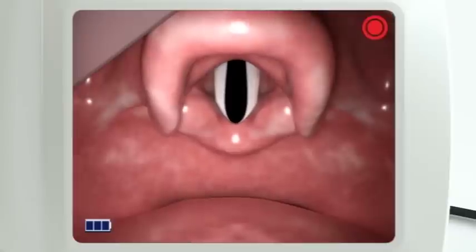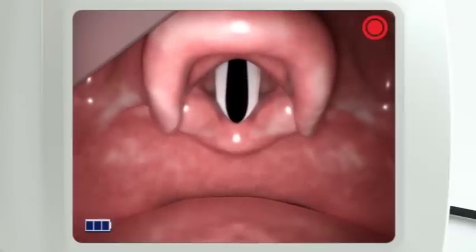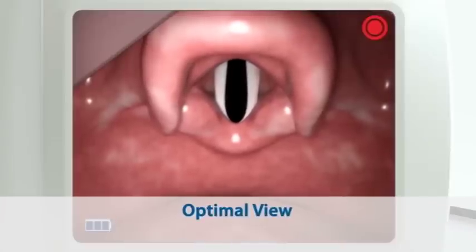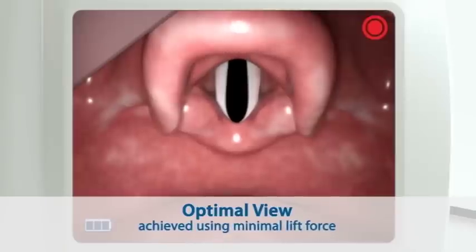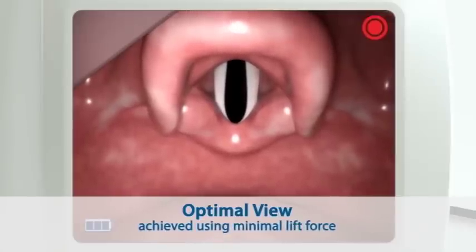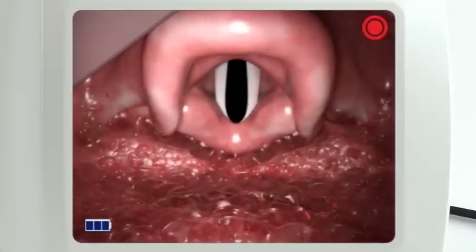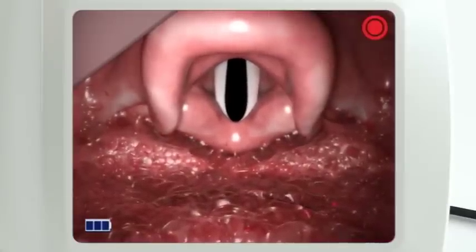When the GlideScope Video Laryngoscope is appropriately positioned, the glottic aperture is centered in the upper third of the video display. This optimal view is achieved using minimal lift force. This provides a wider view and more working space for intubation. The camera position further reduces the effect on the view from blood and secretions in the airway.